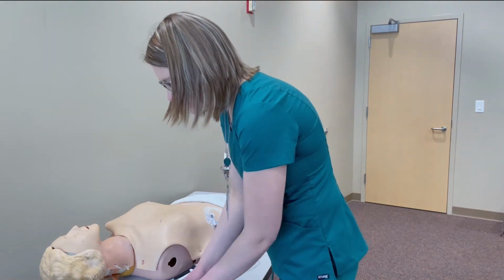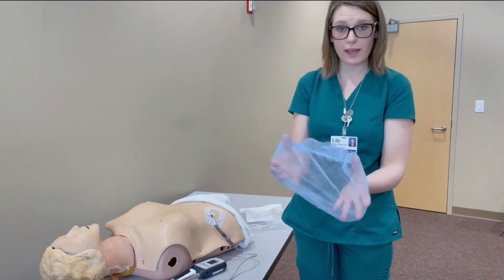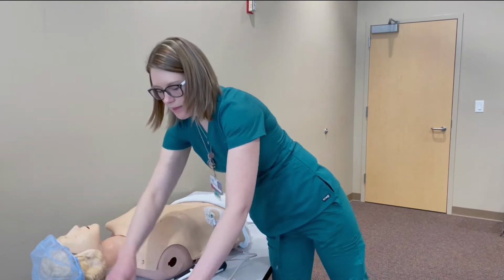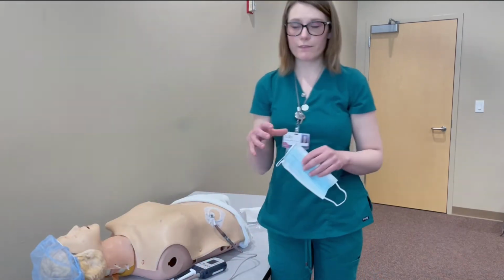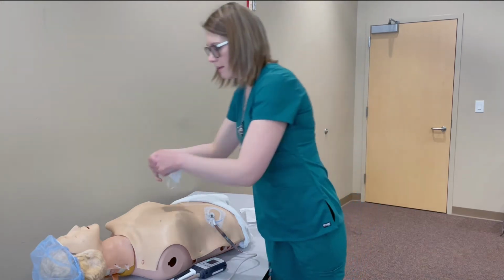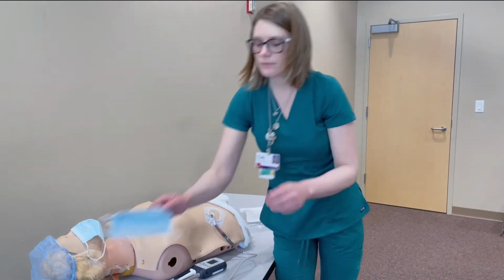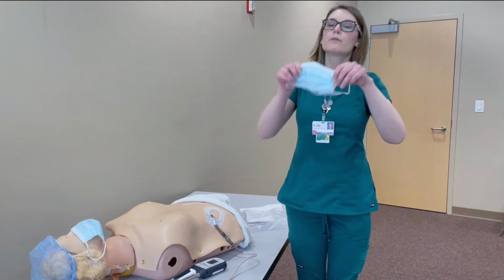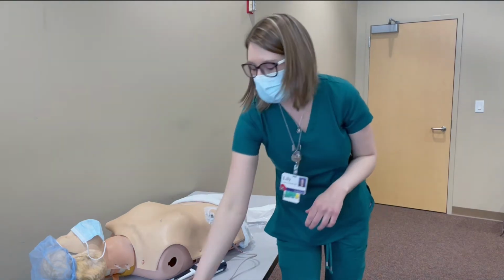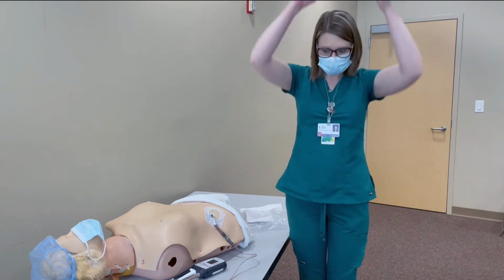So first, you'll want to put a hat and a mask on you and your family member. So we'll put it on your family member. And this is to protect from any germs that may be in the hair or in your breathing from touching the site. Anyone within the room should also have a hat and a mask on. If they do not, just have them go ahead and step out of the room until you're completed with your dressing change.